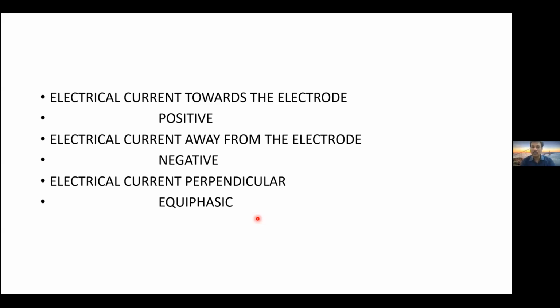Now, the closer the electrode, the more sensitive the electrode is for the QRS complex. It means if you place it right on the heart, your ECG will be very tall, whereas if it is away from the heart, the ECG will not be tall. Now you know why the QRS complex in V1 to V6 is much taller and the limb leads are much smaller, because in these leads all electrical activity is directly recorded over the chest.